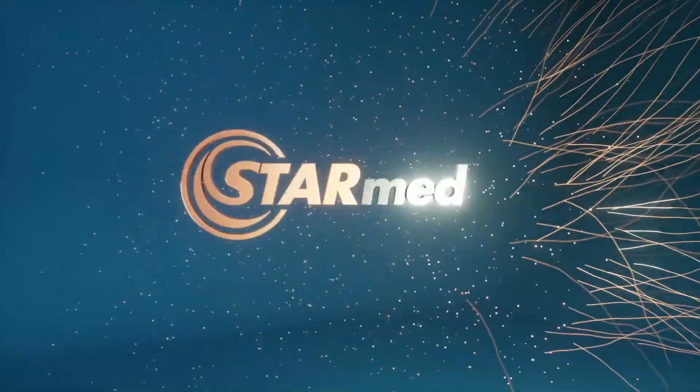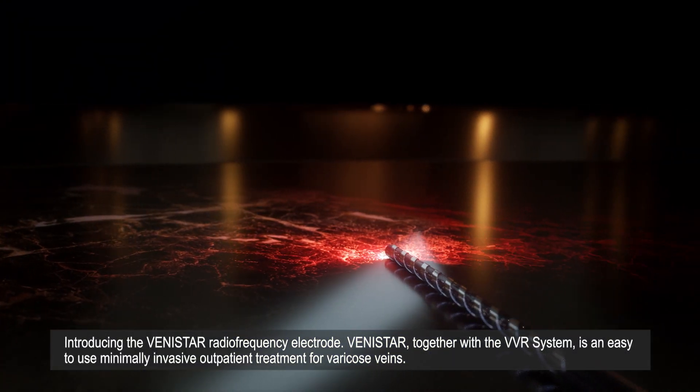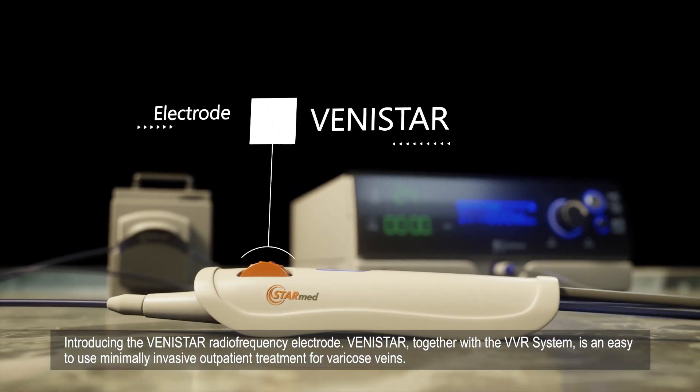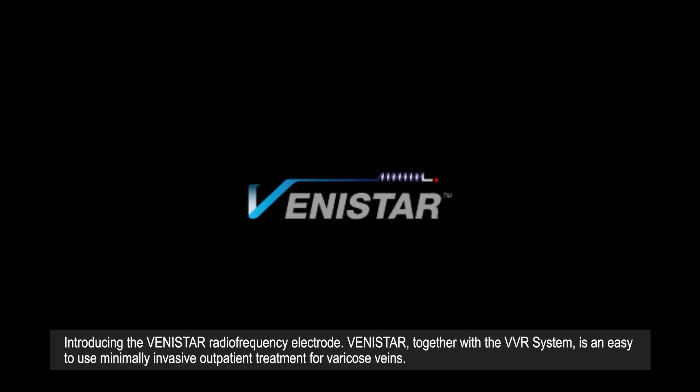StarMed. Introducing the VENISTAR Radio Frequency Electrode. VENISTAR, together with the VVR system, is an easy to use, minimally invasive outpatient treatment for varicose veins.